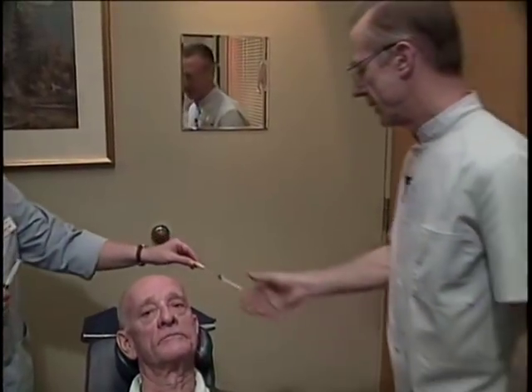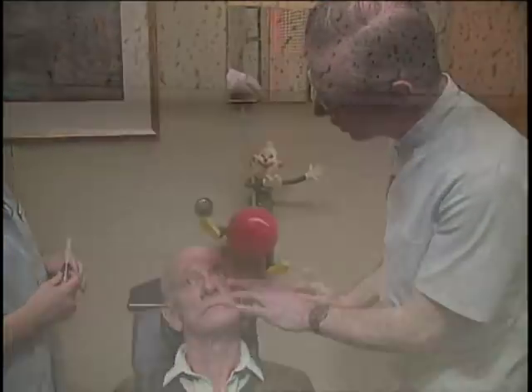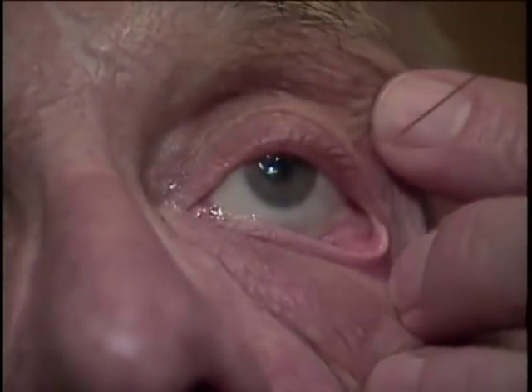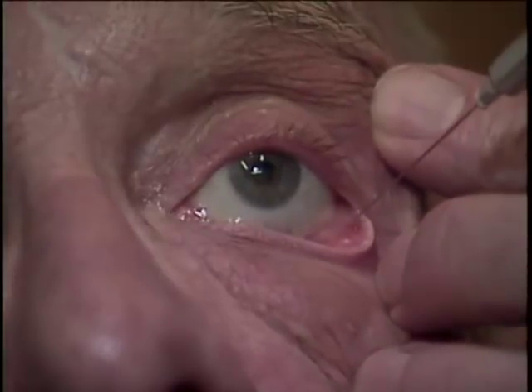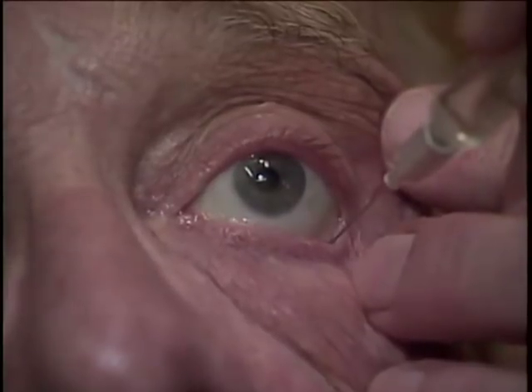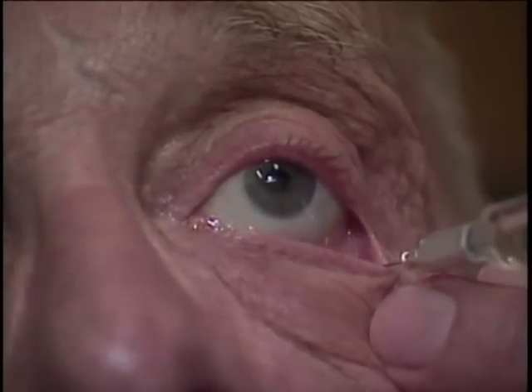I'm in charge of your comfort today. Dr. Gimbel will be doing your operation. I'll be very gentle with the two needles I'll be using. The following section will refer in detail to the placement of the inferotemporal needle, entering transconjunctivally and tangentially, with precise instruction about depth of penetration and direction angle.